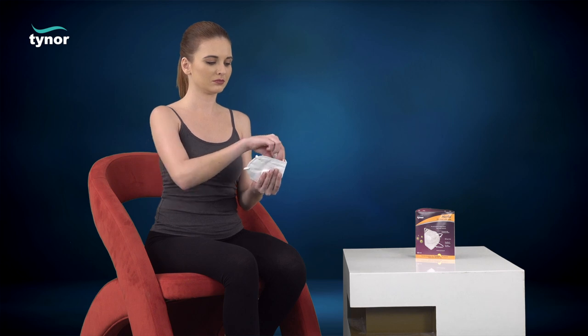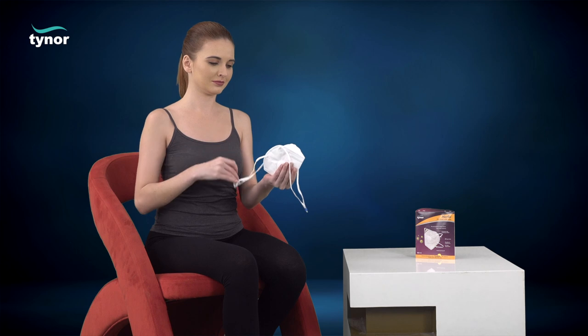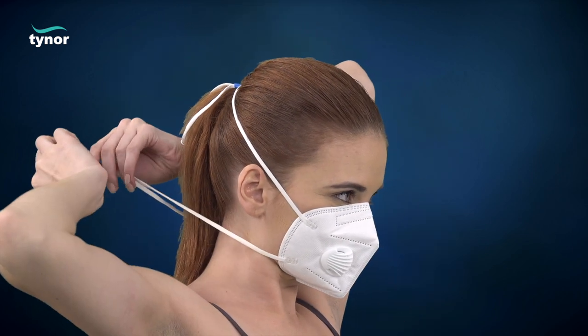Cup the mask in your hand with the nose clip towards the fingers and straps hanging down. Position the mask on the chin with the nose clip up. Pull the top strap over your head and position it above the ears. Next, pull the bottom strap over your head and position it below the ears.